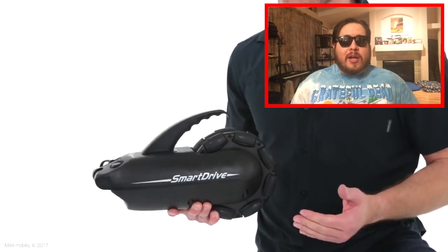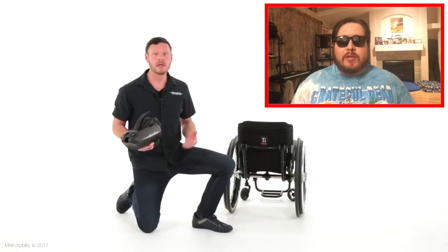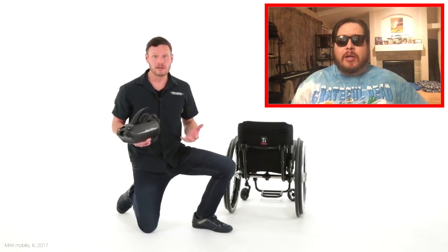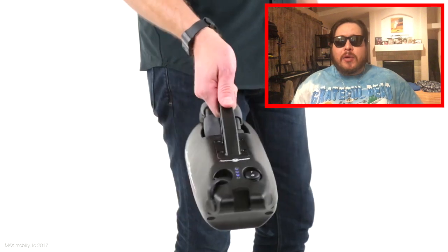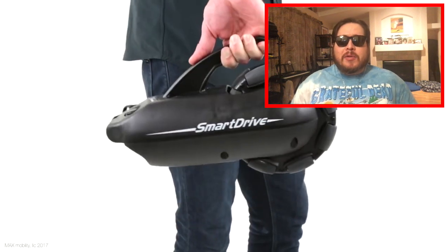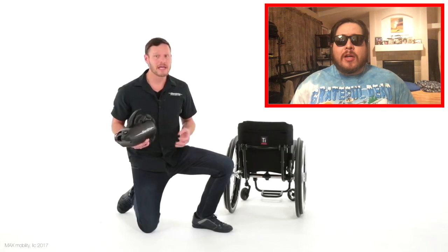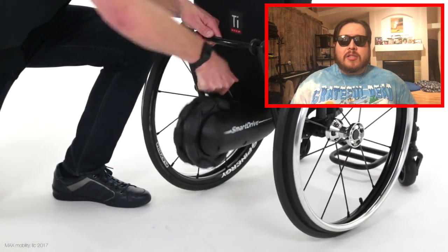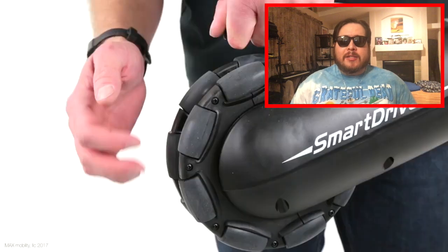I really was not wanting this SmartDrive because it was something you attach to the chair. I was worried about: is it going to stay? How well is it going to work? But once I was in it and it started going, I knew right away that this is the one — the device that I was looking for. This is the one that's going to allow me to make the videos that I want to make. This is exactly what I was looking for, and BAM.